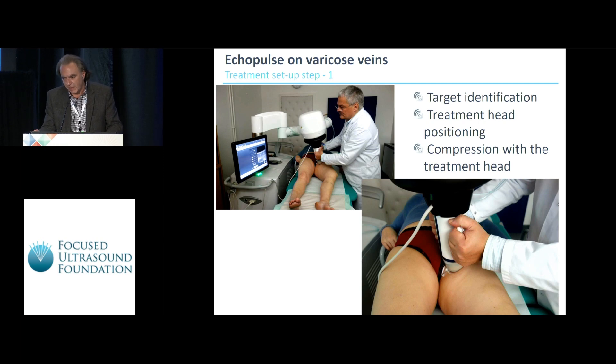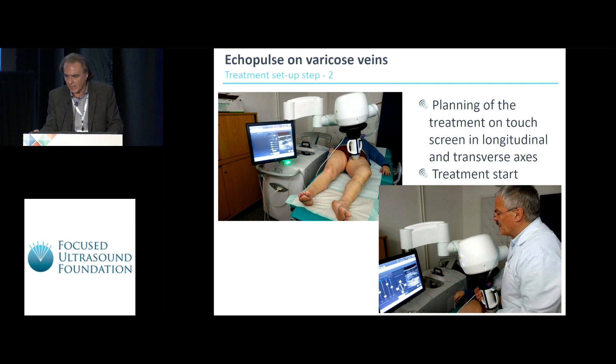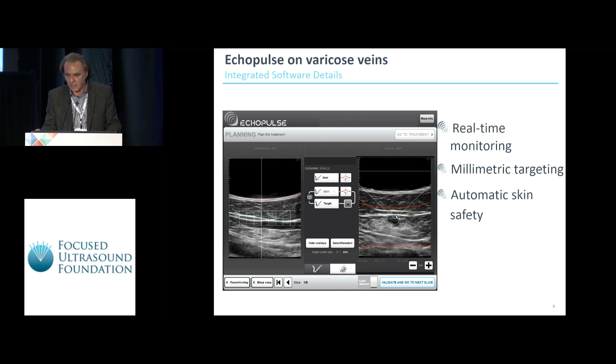The first step is target identification. Then the treatment head is positioned on the leg at the starting point of the treatment and compressed over the vein. Afterwards, planning of the treatment begins on the touch screen in both longitudinal and transverse axes, and then the treatment can start. You can see on the touch screen how the monitoring is performed in real time with millimetric targeting and automatic skin safety, which is very important.